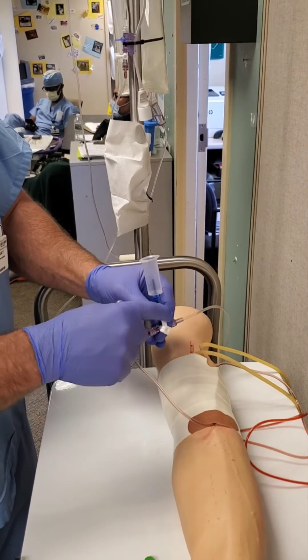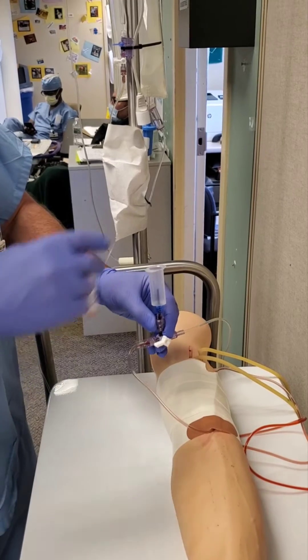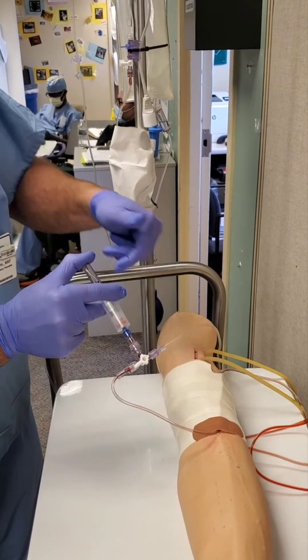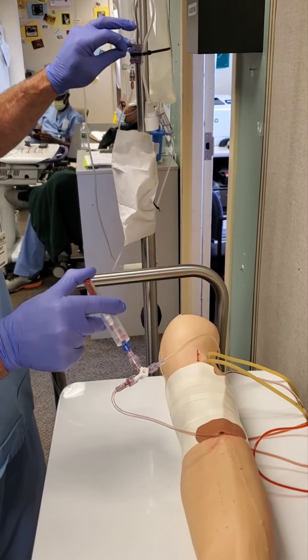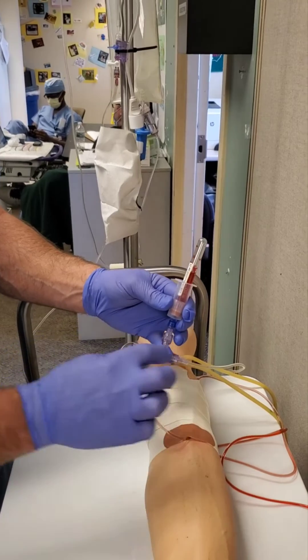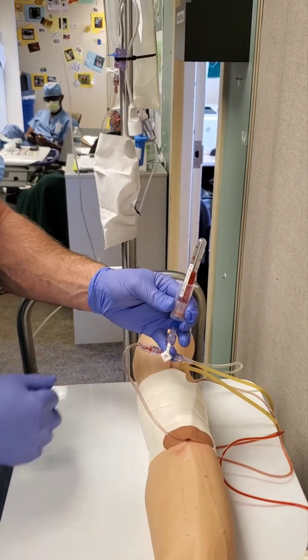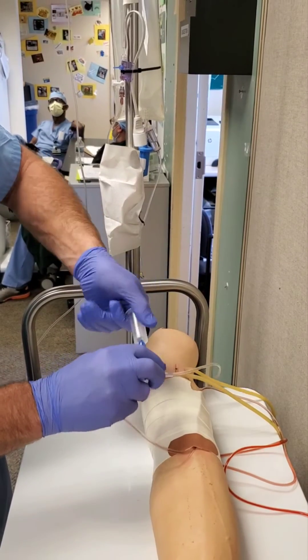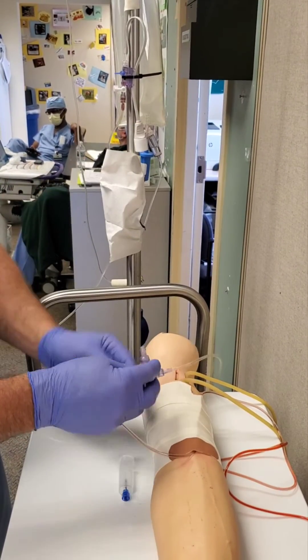Now we need to clean the hub. Turn the stopcock off to the patient, place your vacutainer in there, and pull the pigtail until it is all clear. Return your stopcock to the up position, remove your waste container, and remove the vacutainer.